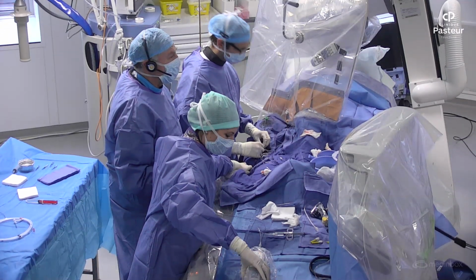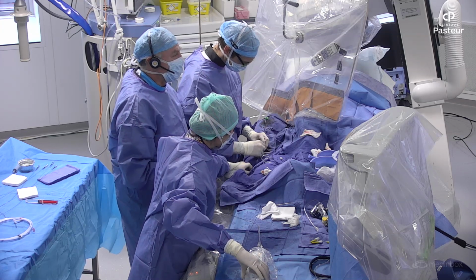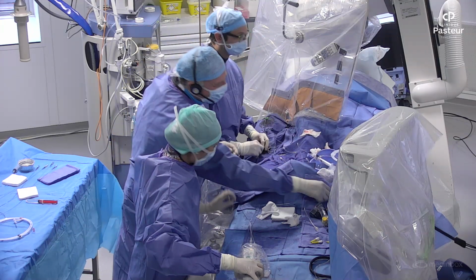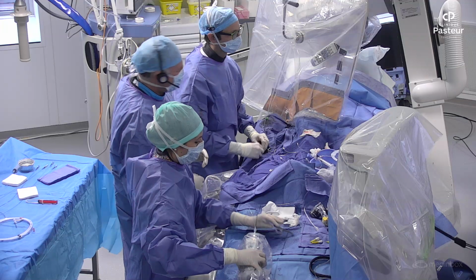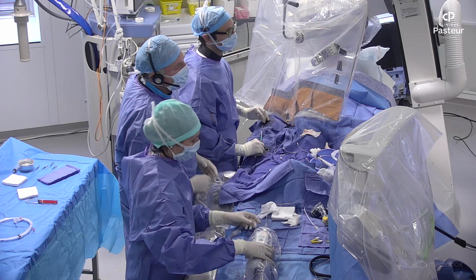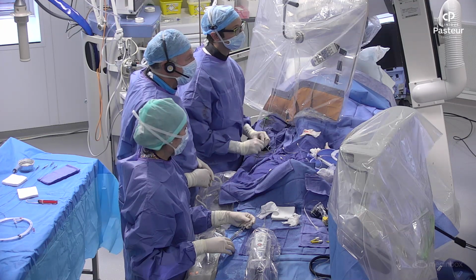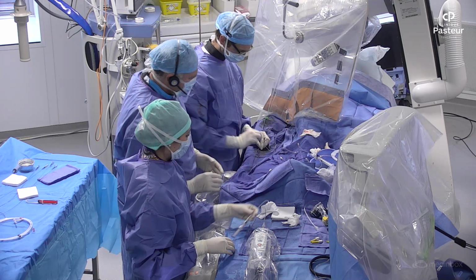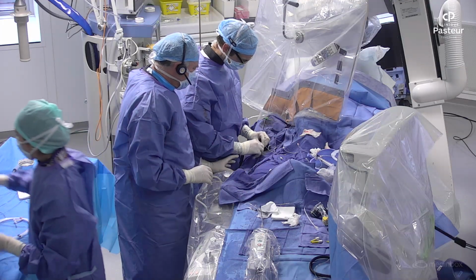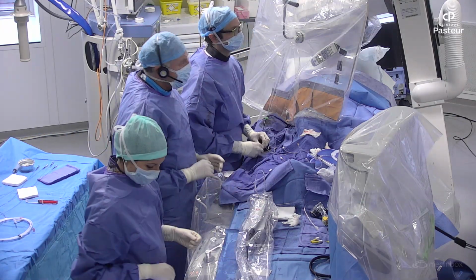Yeah. And may I ask maybe another question? Do you think that 50 milligrams of atenolol will be less effective than a stent for this diagonal lesion? Of course. Medical therapy is the basis of anything we do on the coronaries, of course. I think that here, if you do an FFR, it could be. Maybe we can remove the diagonal branch now. What do you think? The FFR wire is not the best wire. So the only thing you risk is to have a dissection on the ostium, and then it doesn't matter what you measure because it has no clinical implication.